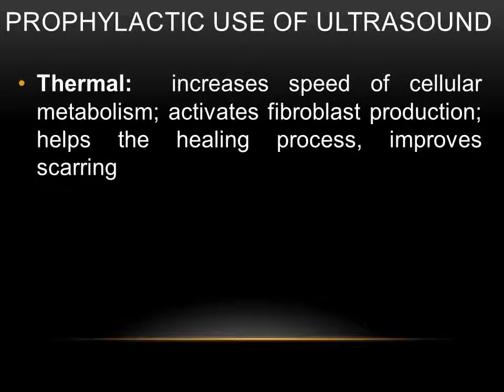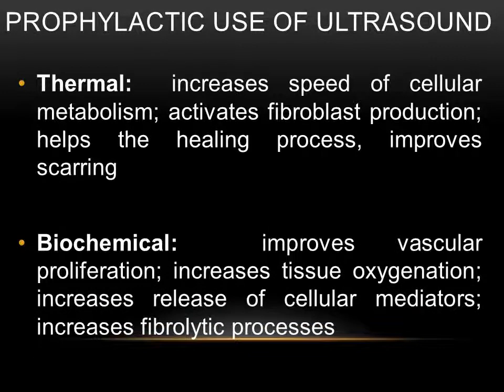The thermal effect increases speed of cellular metabolism, activates fibroblast production, helps the healing process, and improves scarring. While the biochemical effect improves vascular proliferation, increases tissue oxygenation, increases release of cellular mediators, and increases fibrolytic processes.